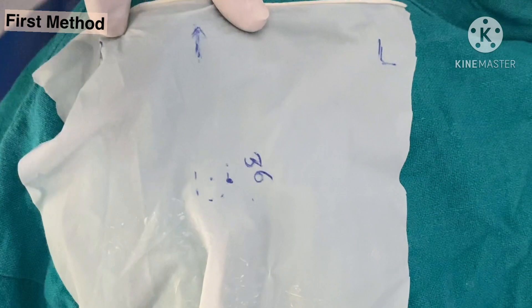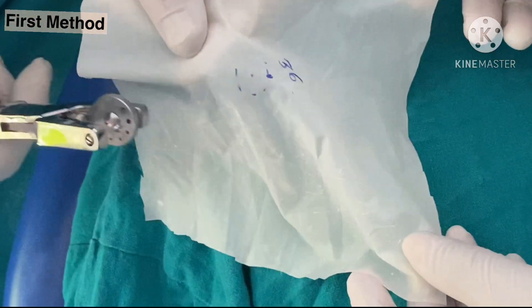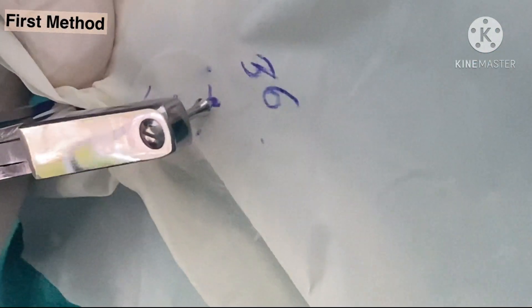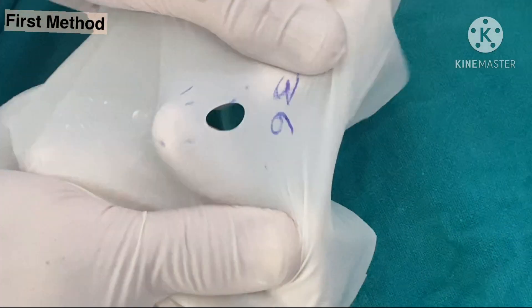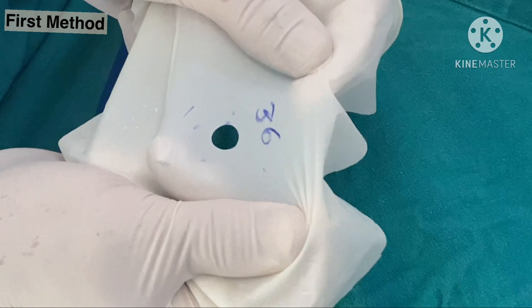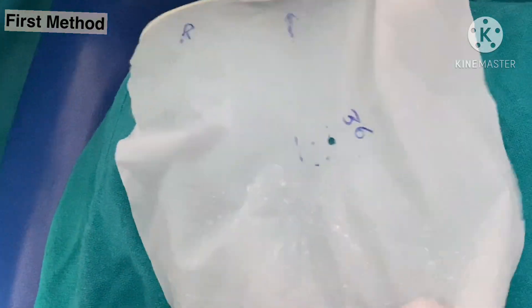Then we mark the tooth. For example, in this case we have to expose tooth 3-6, so we mark a dot. After this, punching is done with the rubber dam punch — you reach the spot you have marked and press. Now take the punched portion out. This is without any tear. If there is a tear, which sometimes happens when you are repeatedly using the punch and it is not working well, you have to do it again, or change the rubber dam punch.